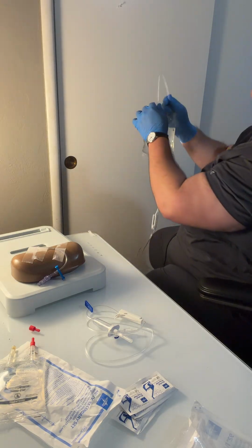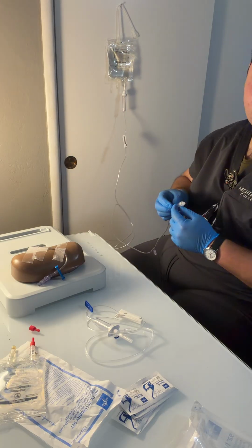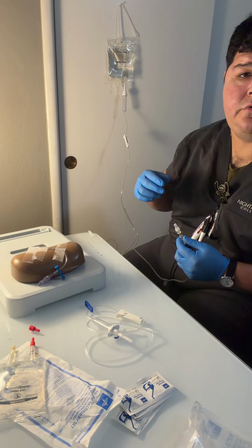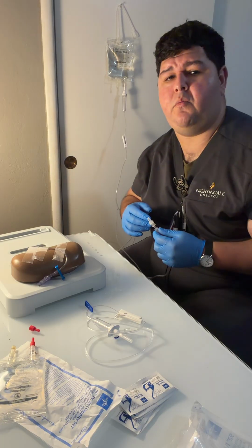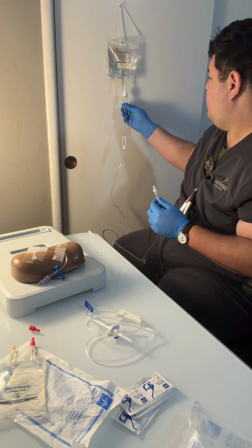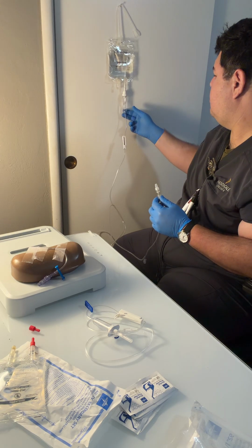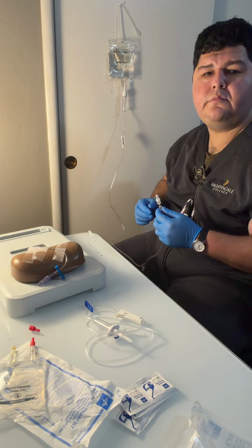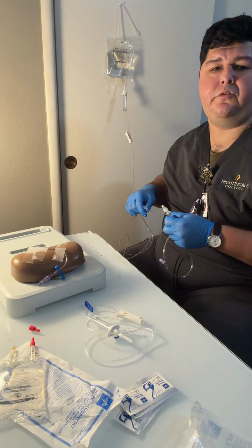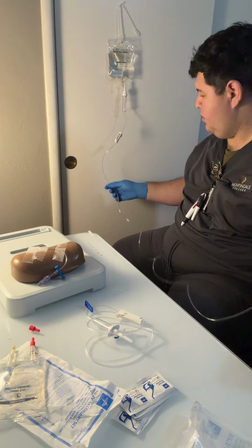There we go. And so we're going to place that ideally on a lower hook so that we know which one's which. And then we're going to squeeze the chamber until half of it is filled up with fluid. Okay. Then we will slowly open the roller clamp until the fluid has begun filling our tubing, and then no air bubbles will be present.